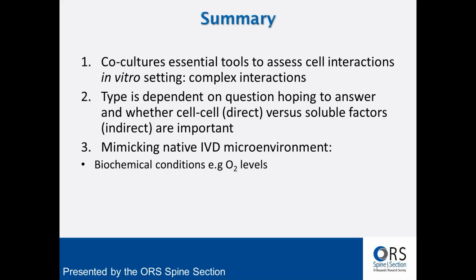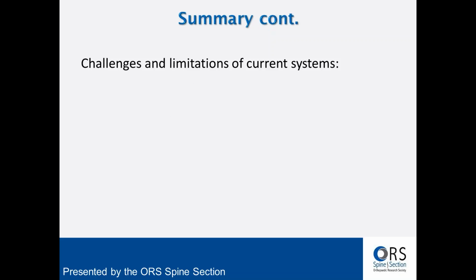So looking at biochemical conditions, for example, oxygen levels, the media that you're using, also incorporating the loading microenvironment, your healthy versus disease states, and also what cell types you are incorporating into your system.